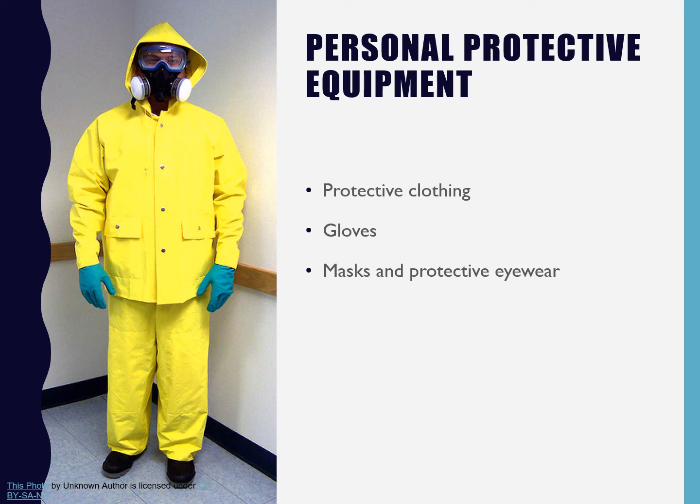Your book will talk about how, because there's no aerosols created in dental radiographs, you don't have to wear the mask and glasses, but completely ignore that. Right now with COVID, we do wear a mask and glasses. And I mean, just all the time, even if it's not required, just wear your mask and glasses, because they breathe on you, and you don't necessarily want to be exposed to that. And so those are the mandates.